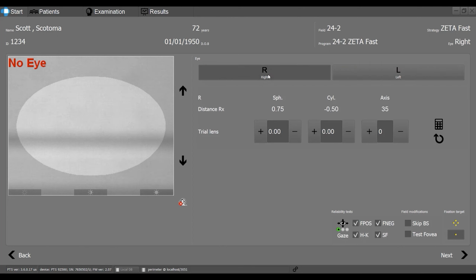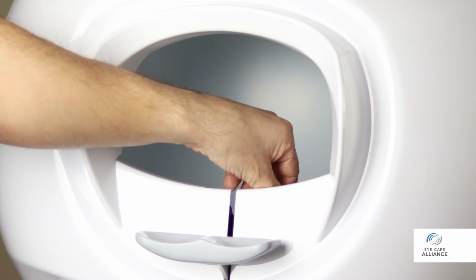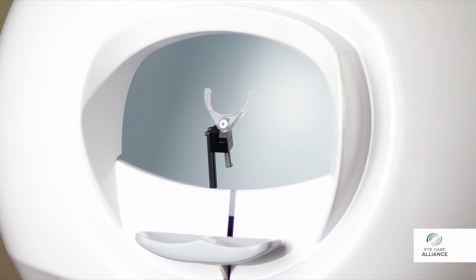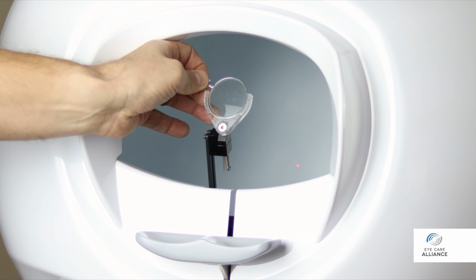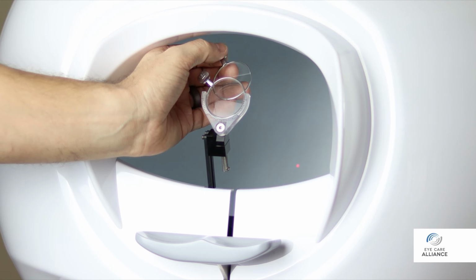After selecting the eye, the trial lens information will be displayed below. Use the calculator icon to generate the correct trial lenses to be used. If values remain 0, no trial lens is needed. If a trial lens is suggested, bring the trial lens holder to its upright position and place the trial lens into a groove. If both spherical and cylindrical lenses are needed, position the lenses in the order that the prescription is listed: sphere lens in the front, closest to the patient, and the cylindrical lens in the back.